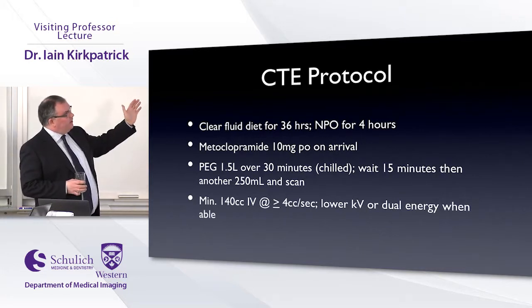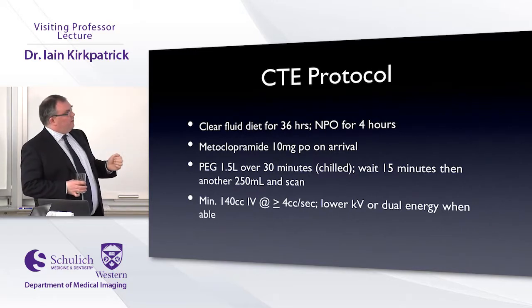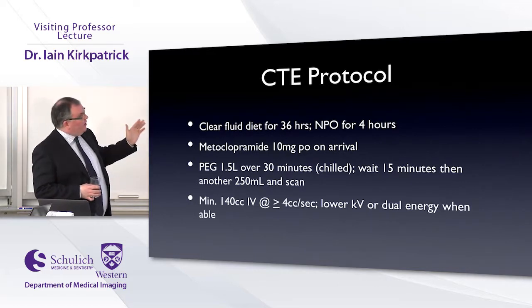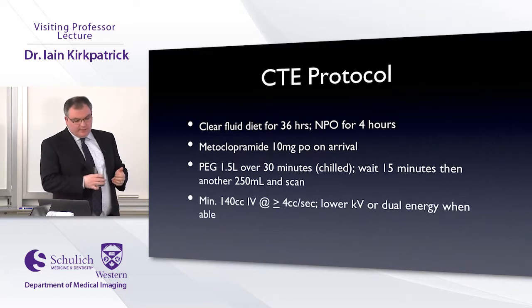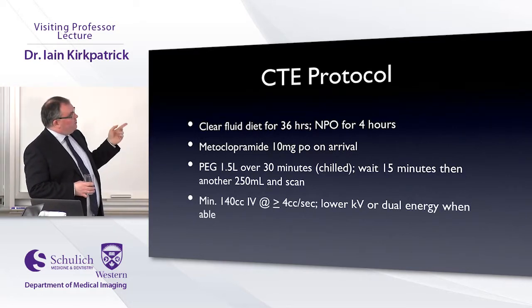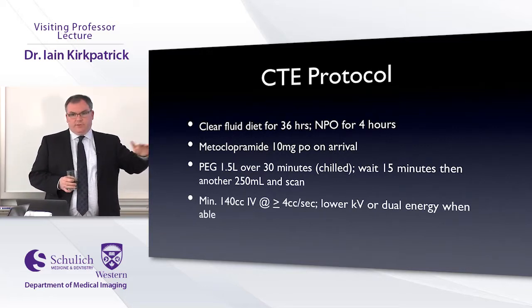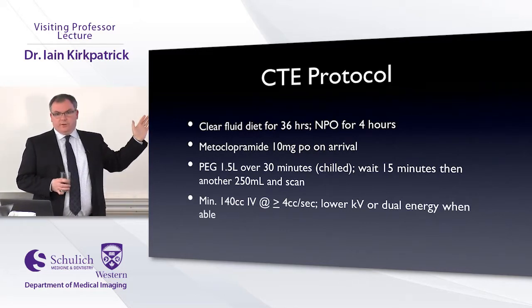So you let them have dinner and then nothing afterwards, and then the next day it's all clear fluids, and then NPO for 4 hours, and you're pretty much guaranteed that there's not going to be anything in your bowel. It's a little rough, I admit, but if we're really going to be serious about finding these lesions, I think it's probably necessary, and whenever we backed off on this, historically, we always ran into trouble. We give people metoclopramide when they come, and that does two things. It makes sure that the polyethylene glycol you give to them is going to reach the TI by the time you're going to scan, and it also basically means that nobody is going to vomit up the polyethylene glycol, and they practically never do.